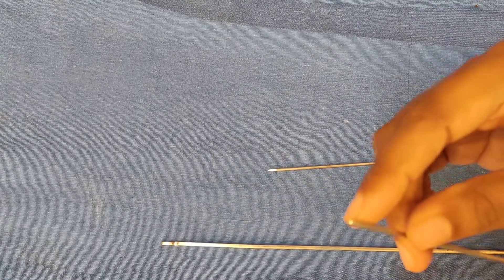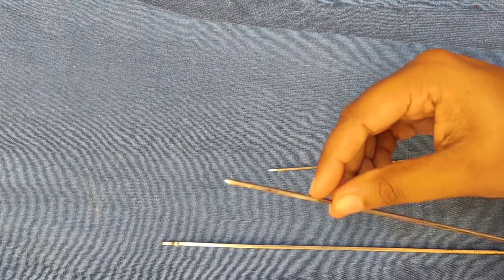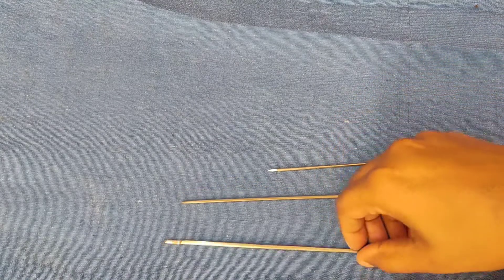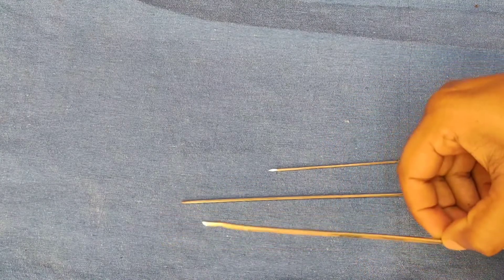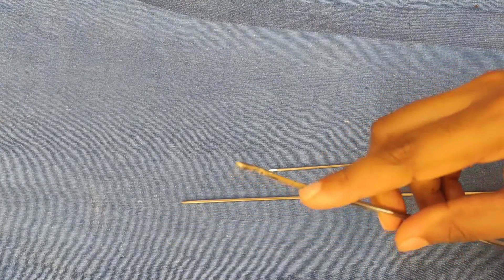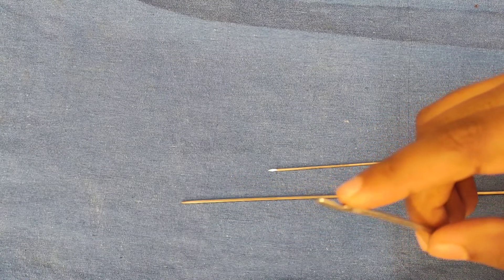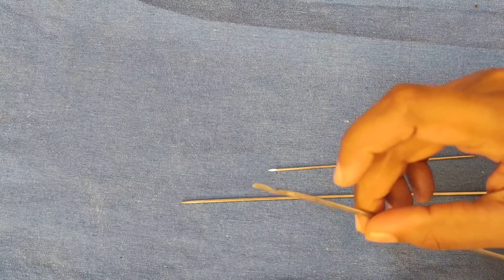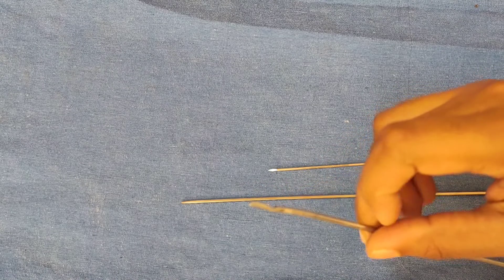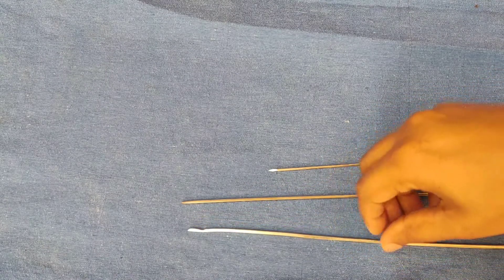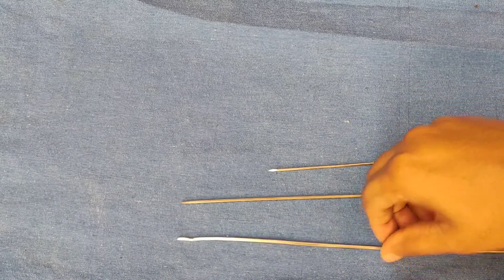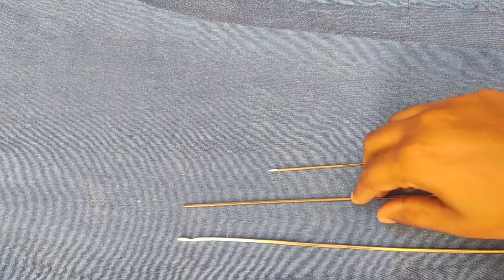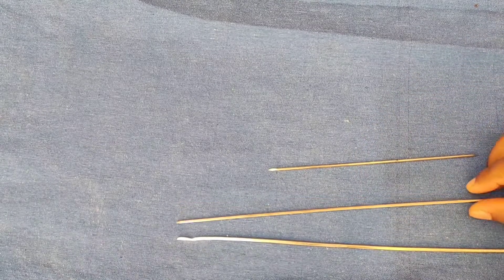Another end is tongue shaped for a radial square nail and pointed for an ulnar square nail. It has a square shaped shaft which provides rotational stability. The principle is three point fixation. Uses: for fracture both bones forearm, for fracture fibula, for fracture humerus.